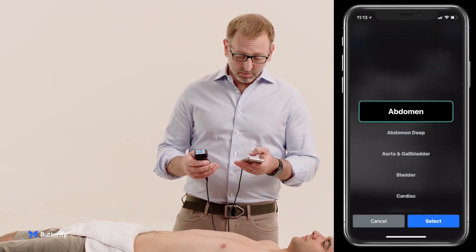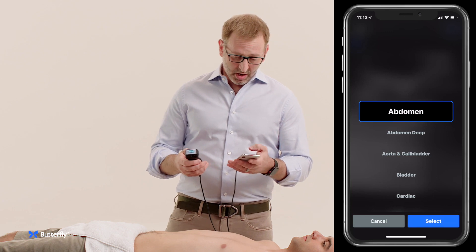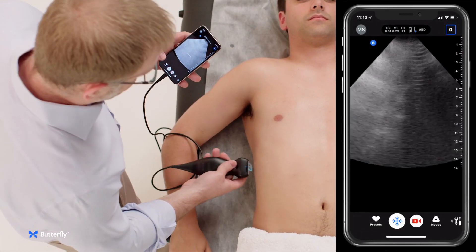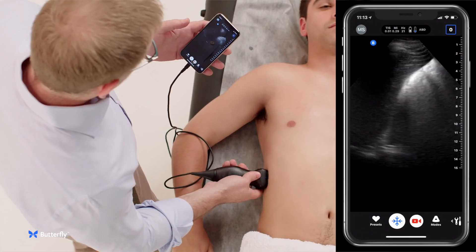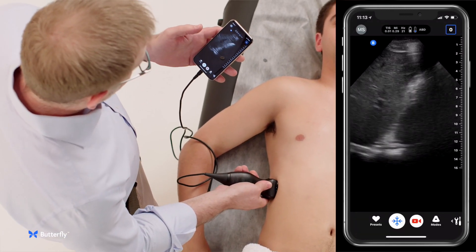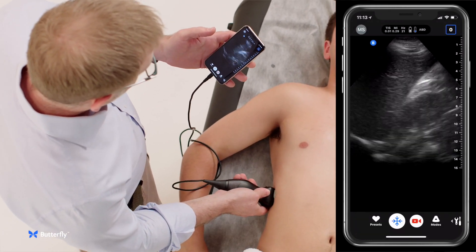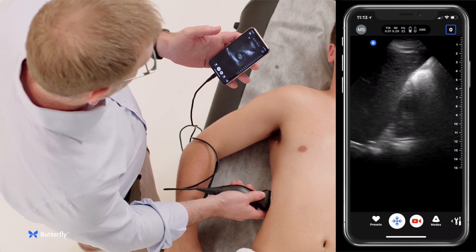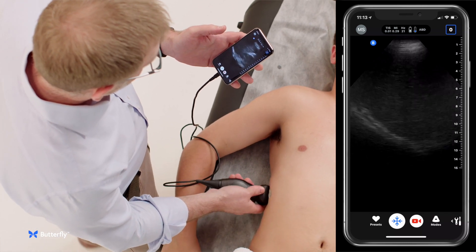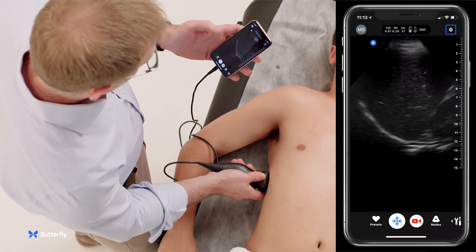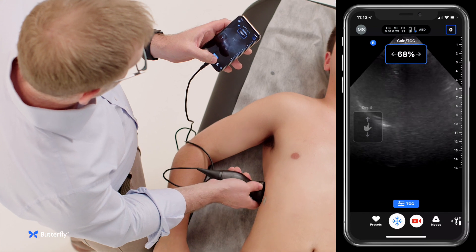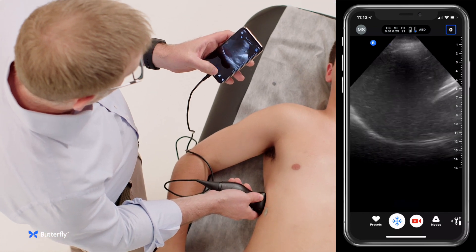We'll start off with an abdominal preset and look in Morrison's pouch — we identify the liver and the kidney, we look in Morrison's for any free fluid, then slide up and look above the diaphragm for any fluid in the thoracic cavity.